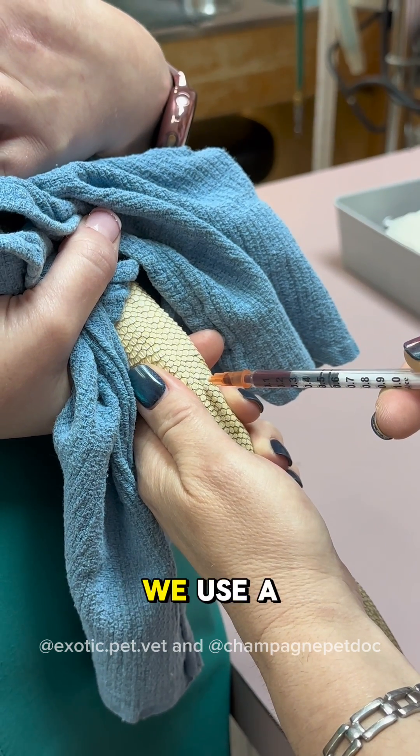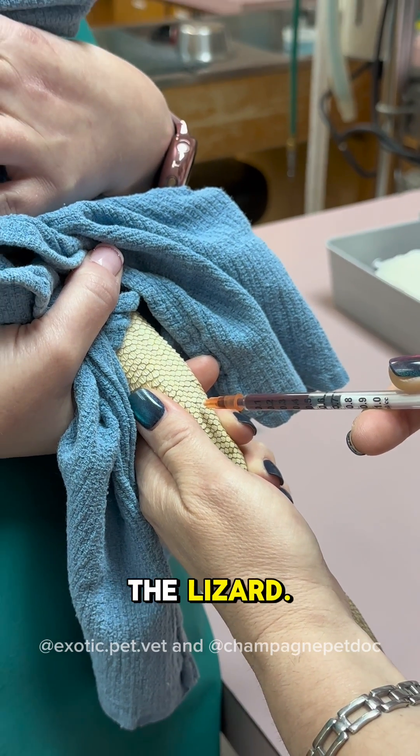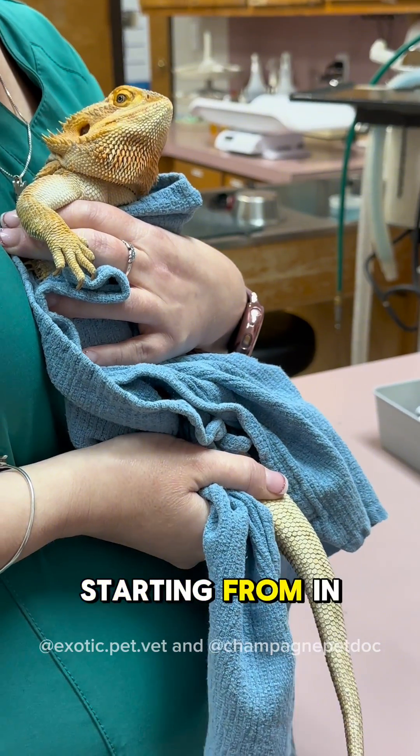After cleaning the tail, we use a 1ml syringe with a 25-gauge needle to draw blood, but this will vary depending on the size of the lizard. The angle varies on clinician preference, ranging from 45 degrees to 90 degrees, starting from in between the scales.